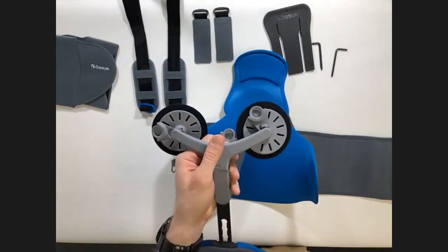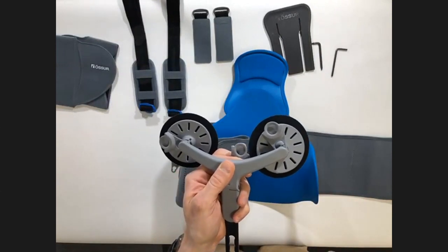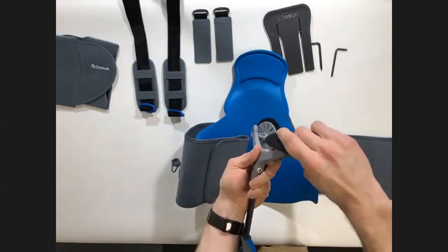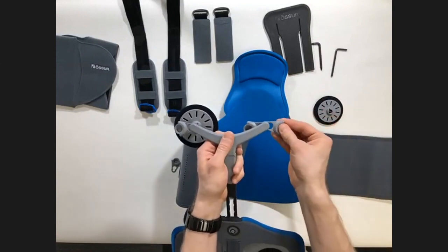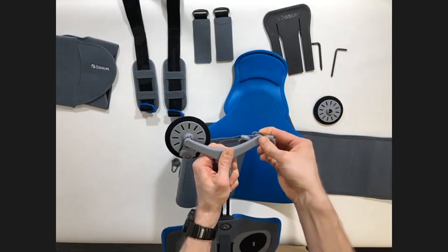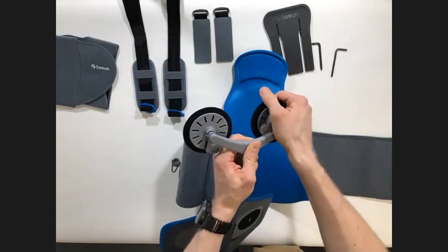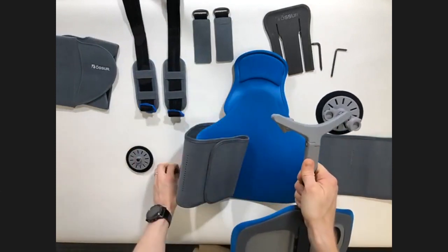So this is if you want to do the very highest level of control, the ATE plus PTE with axilla and over the shoulder straps. So I'm just rotating that off, and then we're just attaching this into here. You can see this is a keyhole shape, slides over the top, clips into position and stays there like that. And we can then clip that into position, and we then repeat this for the other side.